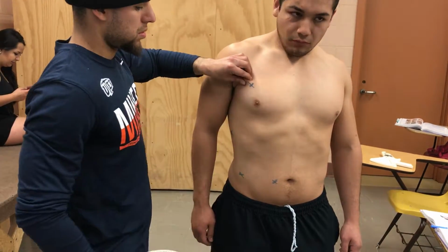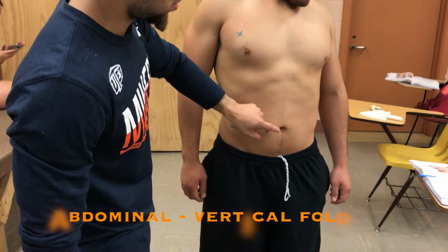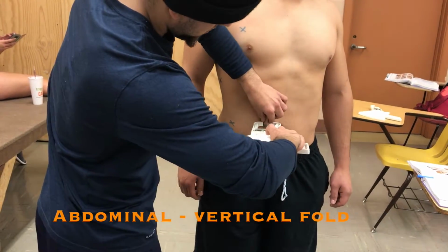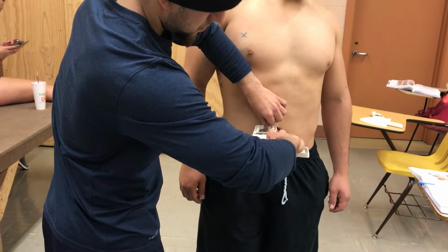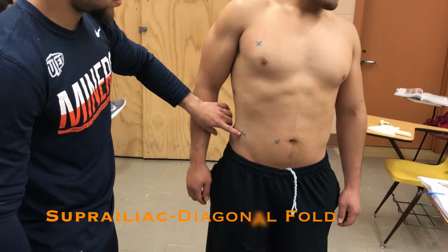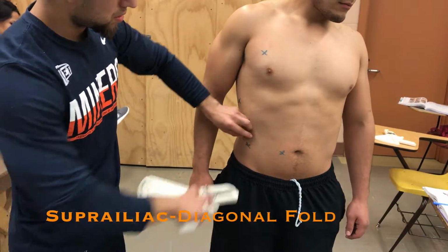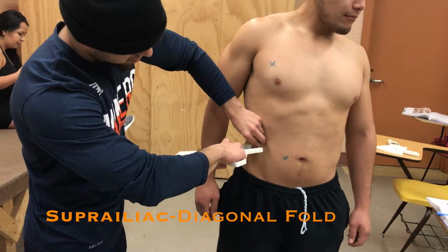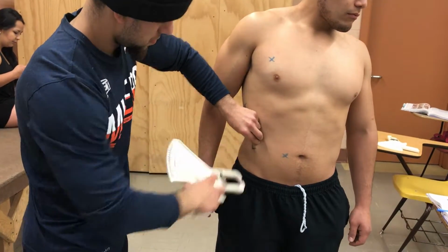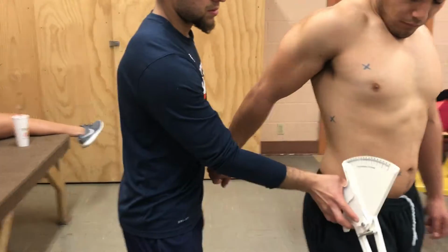The abdominal site is located and marked 2 centimeters to the right of the umbilicus. It is a vertical fold. Collect the reading, then release. For the suprailiac site, locate the client's hip bone or iliac crest. Then mark the site directly above, as the suprailiac site is superior to the hip bone. It is a diagonal fold. Collect the reading, then release.